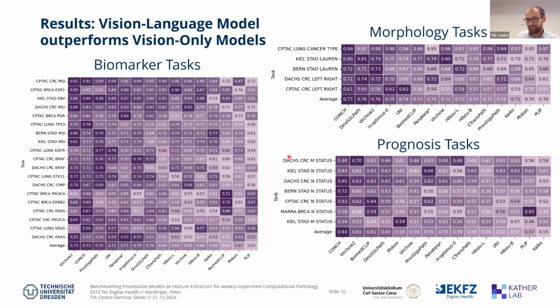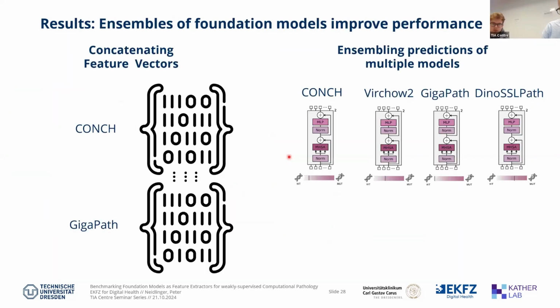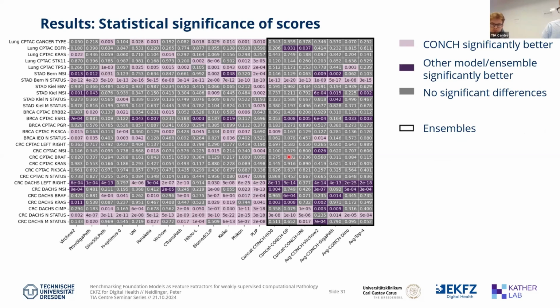It's okay. Maybe it's a naive question, but for your statistical analysis, the heat map, I mean, sorry. Yeah, for this one. I'm not familiar with this test, but do you have to adjust for multiple hypotheses? Like if I wanted to use this in my own research, would I have to do that? Yeah, that would probably be better from a statistical perspective. But this is just always a cutoff of 0.05, even though it is multiple testing. So this table is not adjusted.